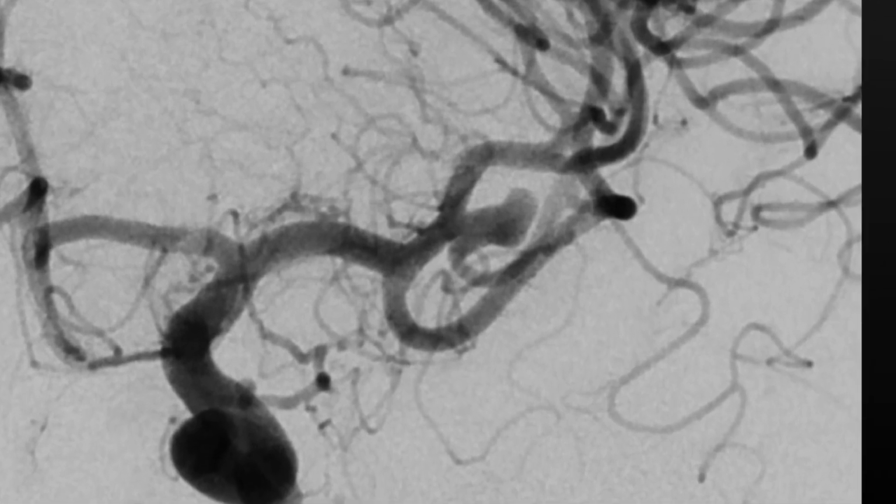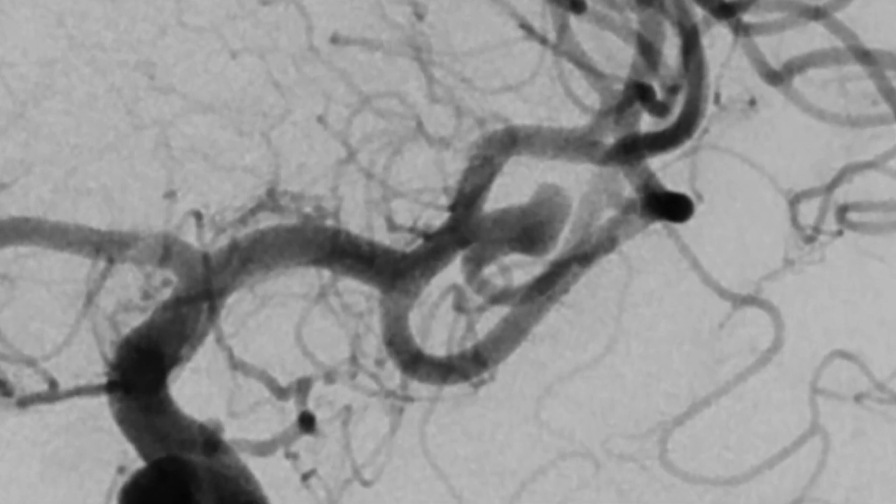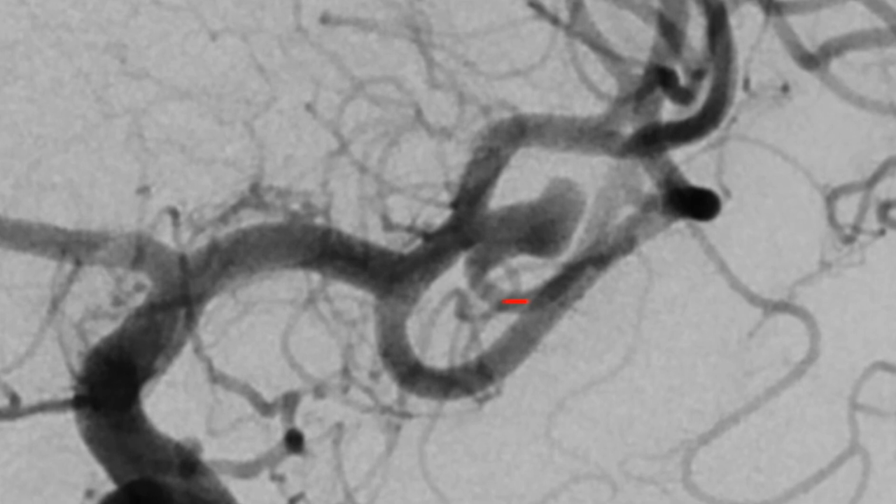Our plan is to implant the microstent from this MCA branch retrogradely and let it end after the first bifurcation, so that we can guarantee a good aneurysm neck stent covering, and then go through the stent struts with the microcatheter into the aneurysm sac, and after that start to fill it with coils.